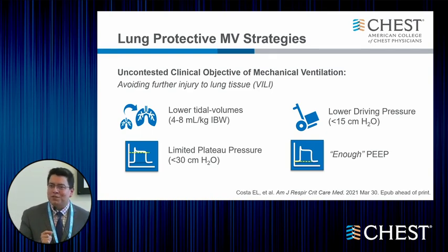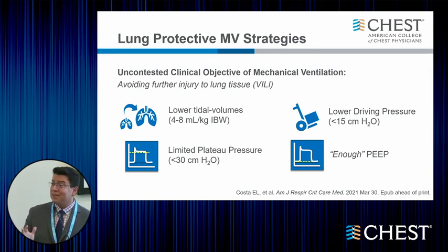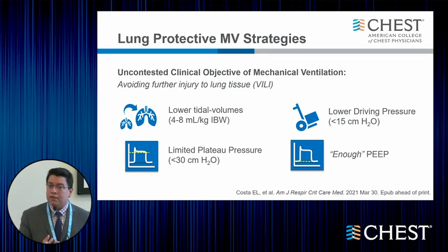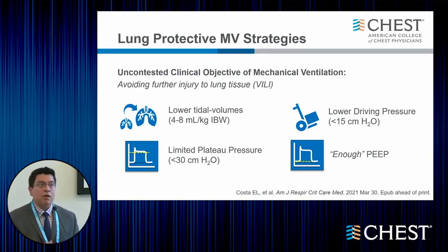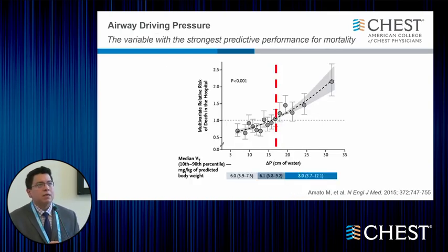So there is a clinical trial for every method of PEEP titration, and all of them have been proven to be negative for improving outcomes. At the end of the day, personalization of PEEP strategy based on lung recruitability, oxygenation, and effort is what we need for lung protective mechanical ventilation strategy.